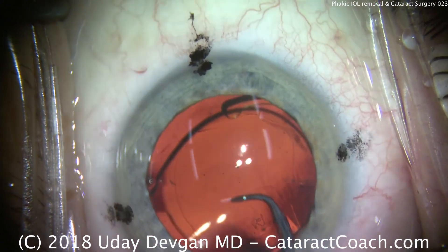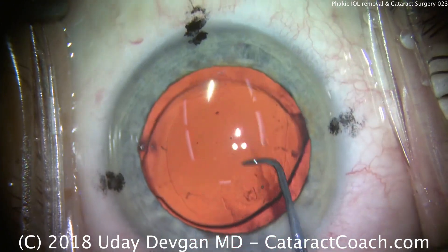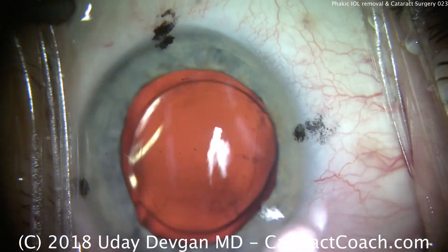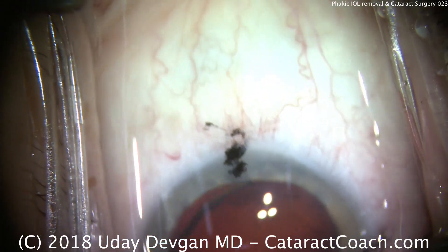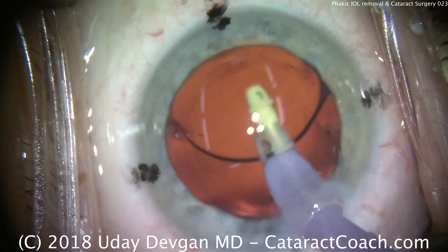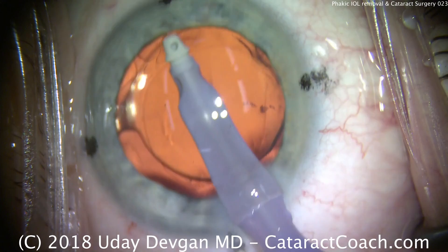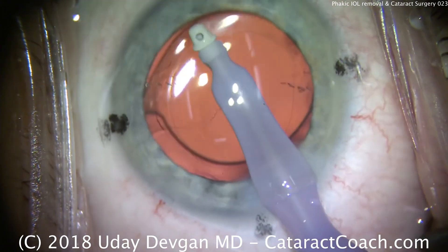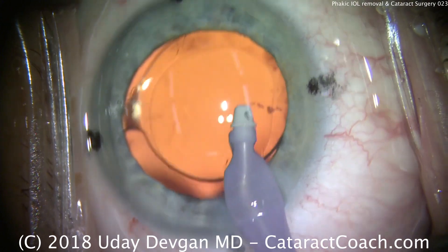We'll remove viscoelastic now. It's important to remove the viscoelastic from underneath the IOL optic. This lens in particular is a little bit tacky, so it will stick in place — it will adhere to the posterior capsule, which is great. Going behind the IOL, remove viscoelastic with high flow and high vacuum settings to really flush out any of that viscoelastic. It's a cohesive viscoelastic, so a lot easier to remove. Then we remove it from the anterior chamber as well. Finally, we'll make sure our toric lens marks are lined up with the marks on the cornea, then seal up the incisions and we'll be done.